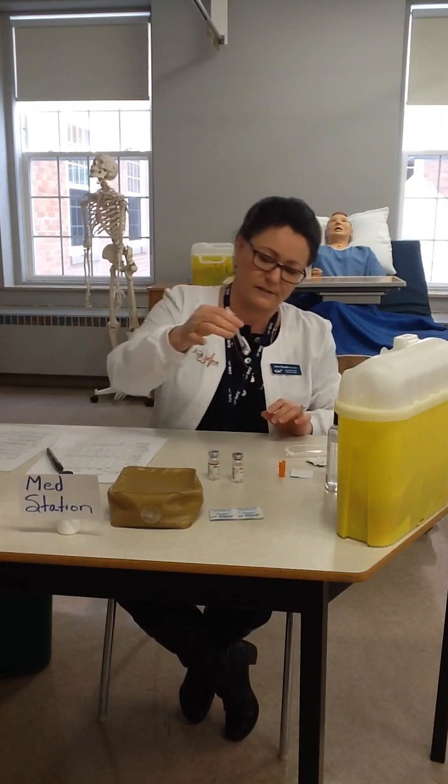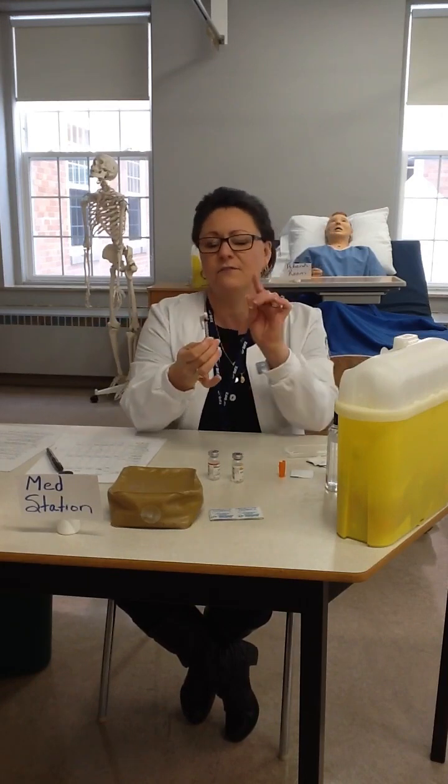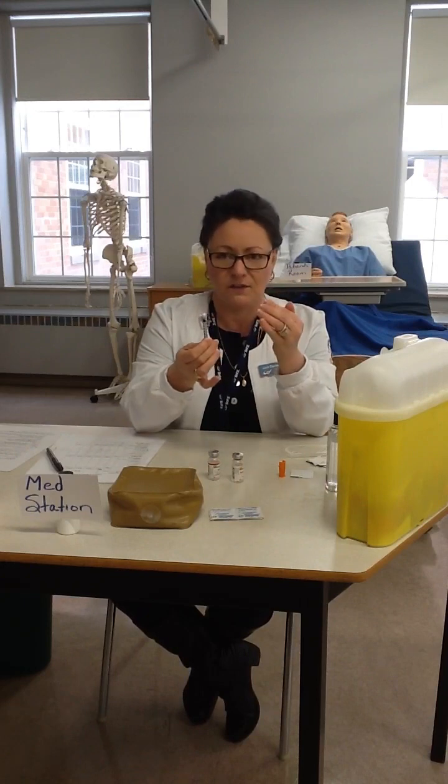So I'm going to pull my cap straight off and away, and it has a flat bottom. It can stand up, so when I need to recap it, I can just line that up and recap it. It's a very small needle. It's a very thin needle. It bends very easily, so we have to be very careful. This is quite a big vial for a tiny little needle like this.